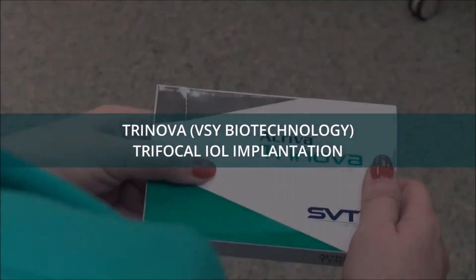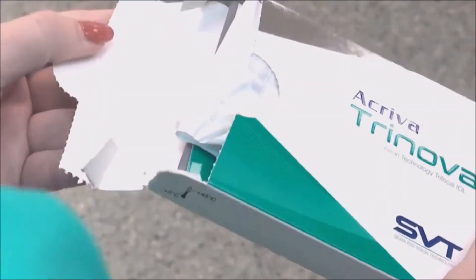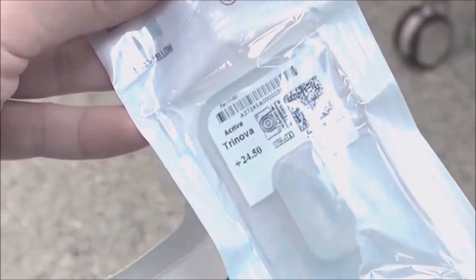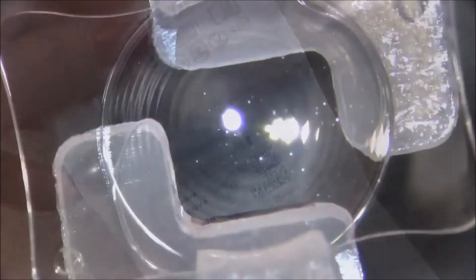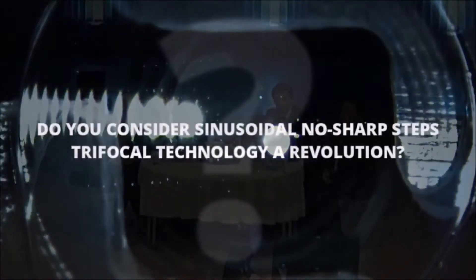That was one of the trifocal implants. Let's have a look at another implant which is truly revolutionary — it's called Trinova, from VSY Biotechnology. This has a sinusoidal pattern on its anterior optic, a trifocal pattern which does not have any sharp steps.